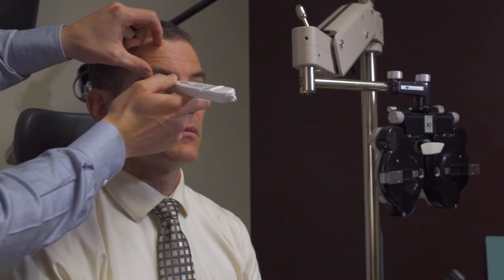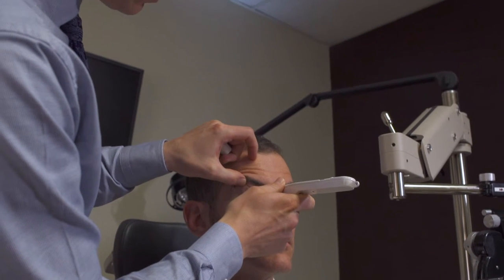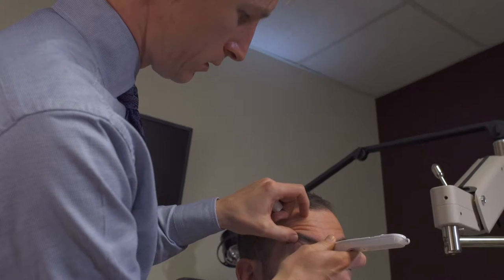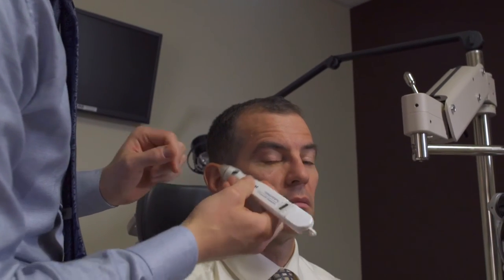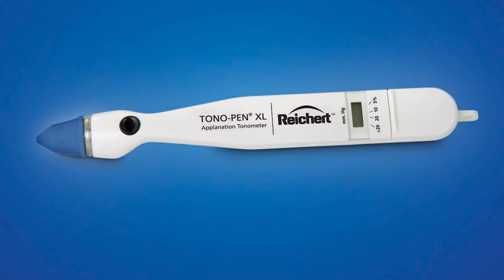Standing to the patient's side so you can directly visualize the Tonopen touching the patient's surface, lightly tapping gives auditory feedback and then gives the measured output and degree of error. We measure 13, which corresponds to his Goldman applanation of 14. The error bar in this case is at the 10% level, so I would consider repeating it to get down to 5%.